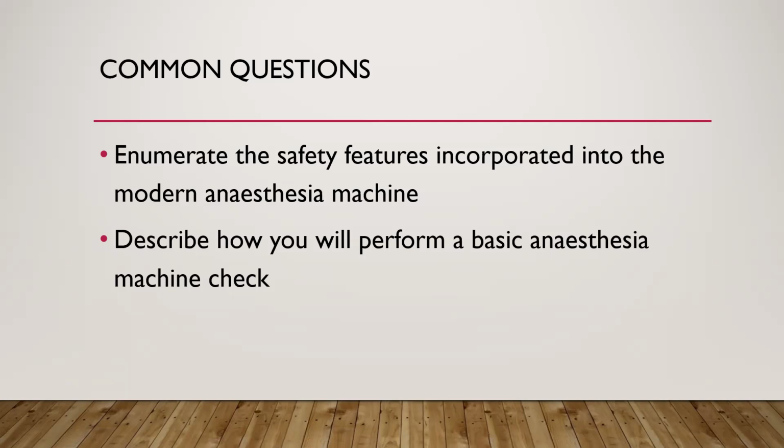That system where nitrous and oxygen are linked together, so that when you increase nitrous oxide, oxygen must go higher. What is it called? Link 25 system. Link 25 proportional system. Have you heard about that before?